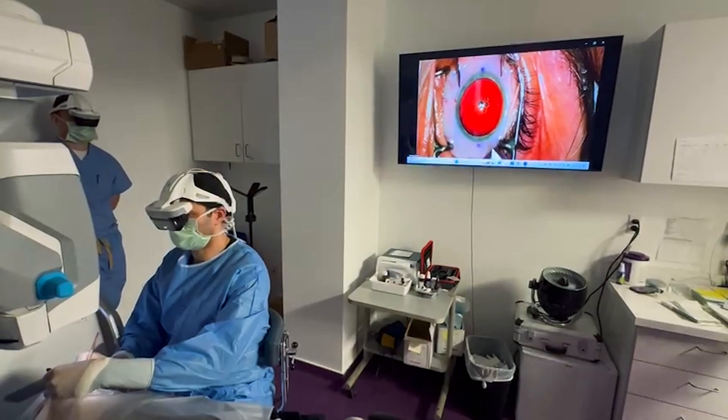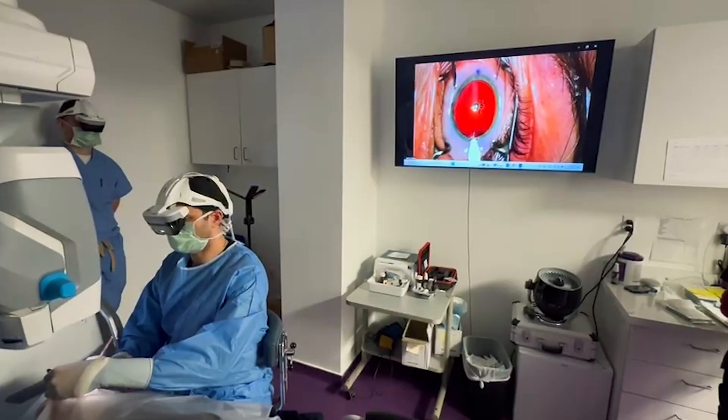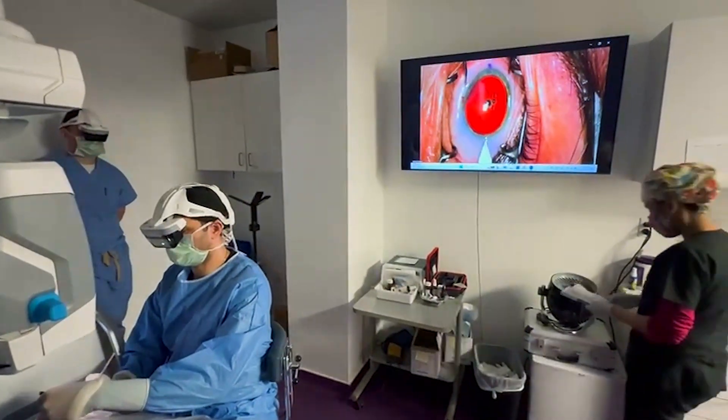This side incision is basically at three o'clock to the patient, and it has a little beveled planar edge to it so it is self-sealing. The patient doesn't feel any of this. They might feel a little pressure, maybe some shadows coming in and out, but certainly no pain.